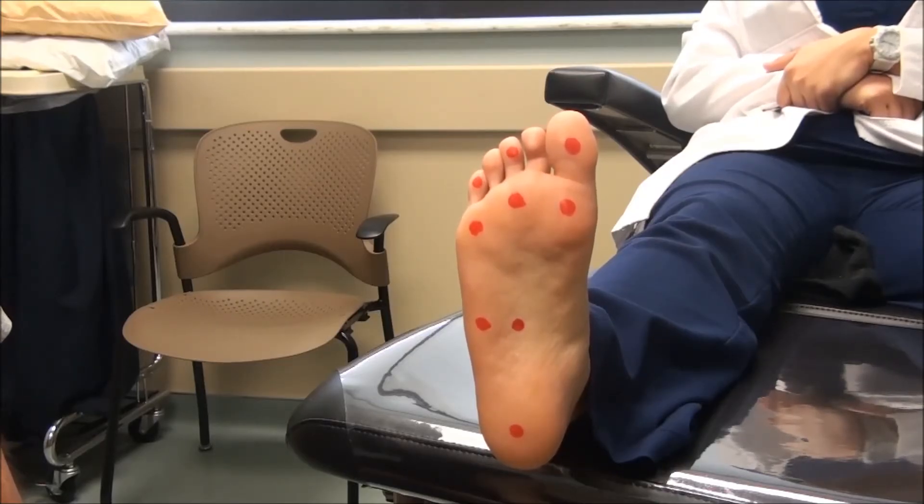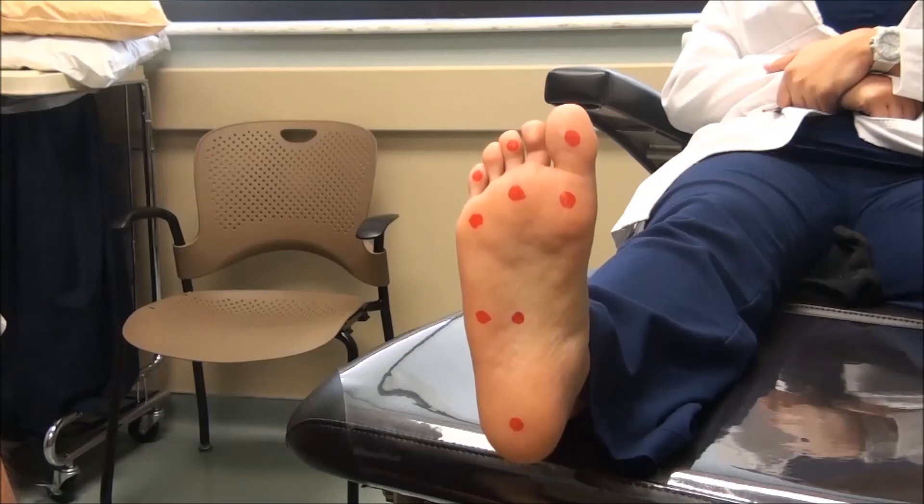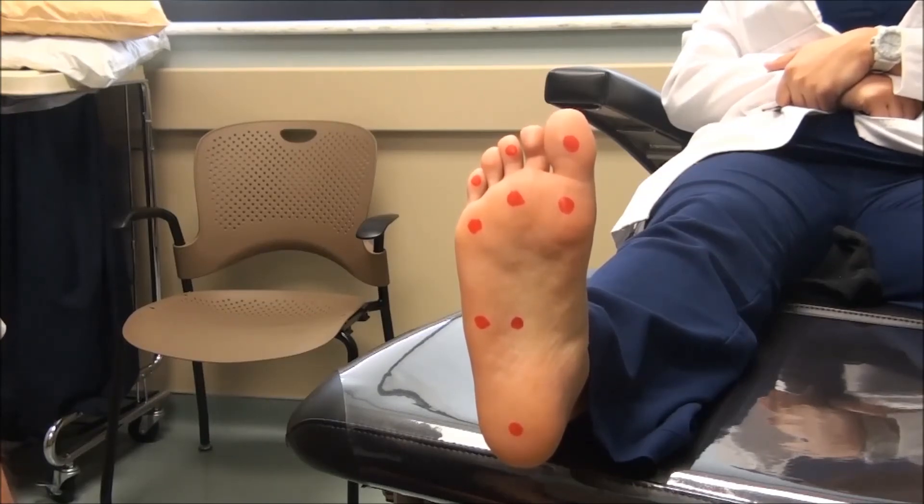The test is very easy to perform and relatively inexpensive. Some of the things you want to watch out for when performing the test is to avoid areas that are obviously ulcerated or have heavy accumulation of callus. Try to find alternative sites if possible.